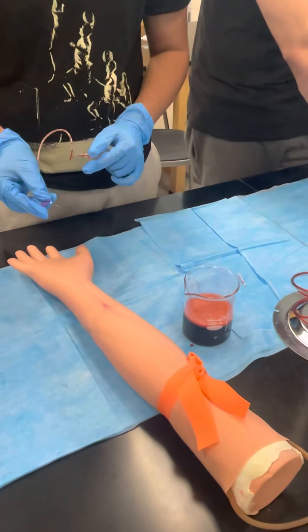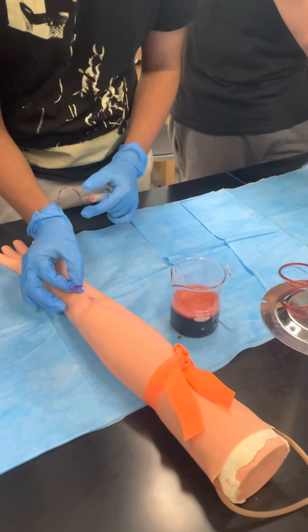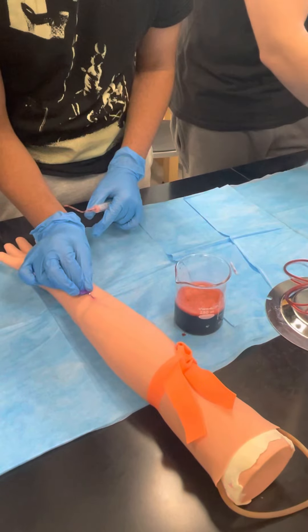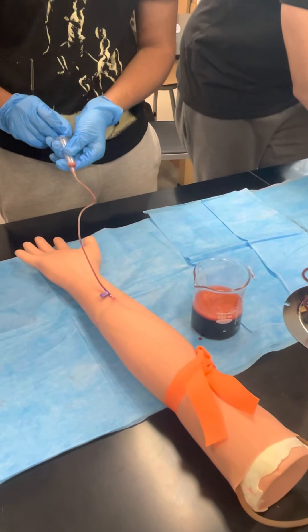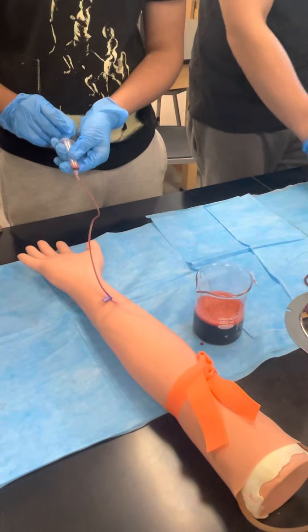You're gonna go in at about 10 to 20 degrees — but you've just touched it again, so you'd have to wipe it off again. Go in halfway. Okay, you're good — there, yeah, there. I'm gonna pull back. Yeah! Let's go, look at that, awesome. Draw your plunger back and see what you're doing.